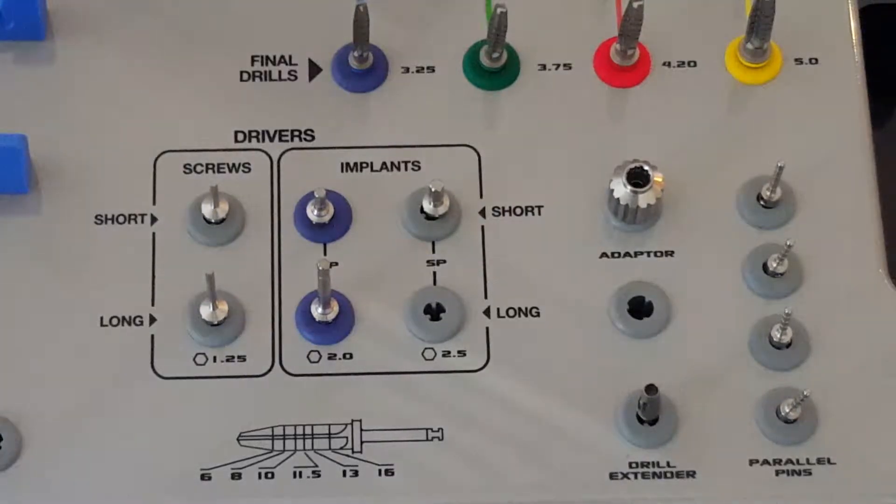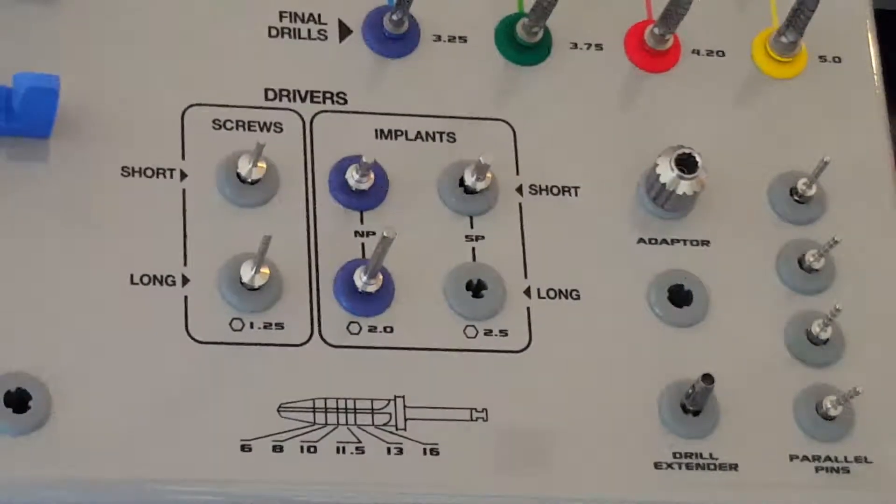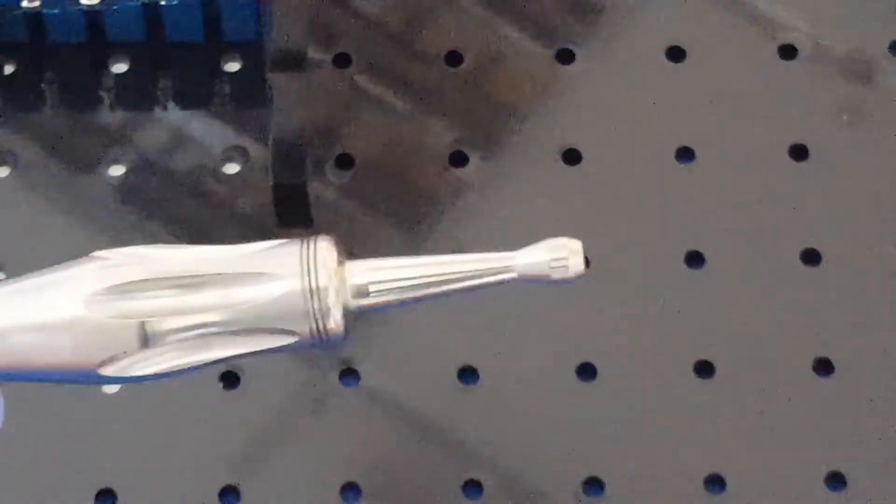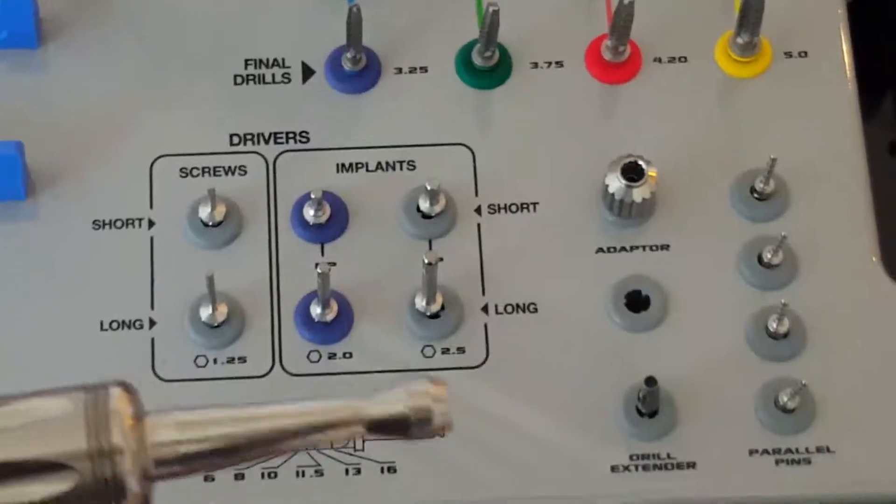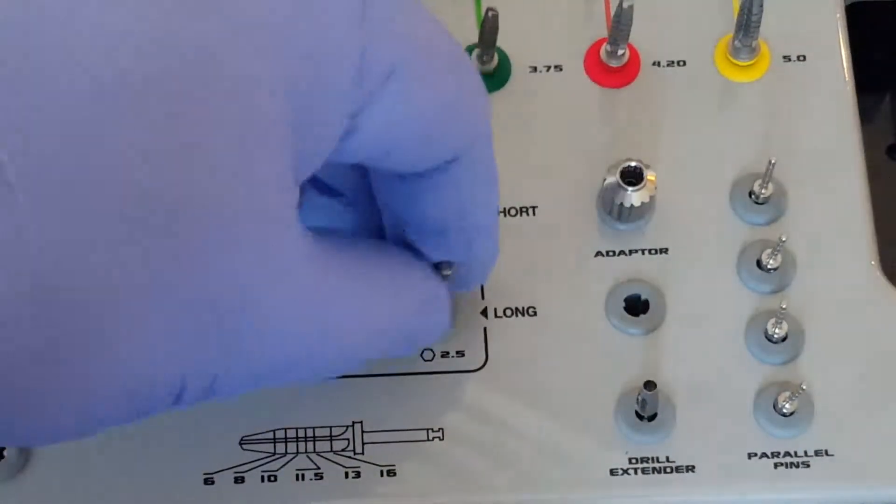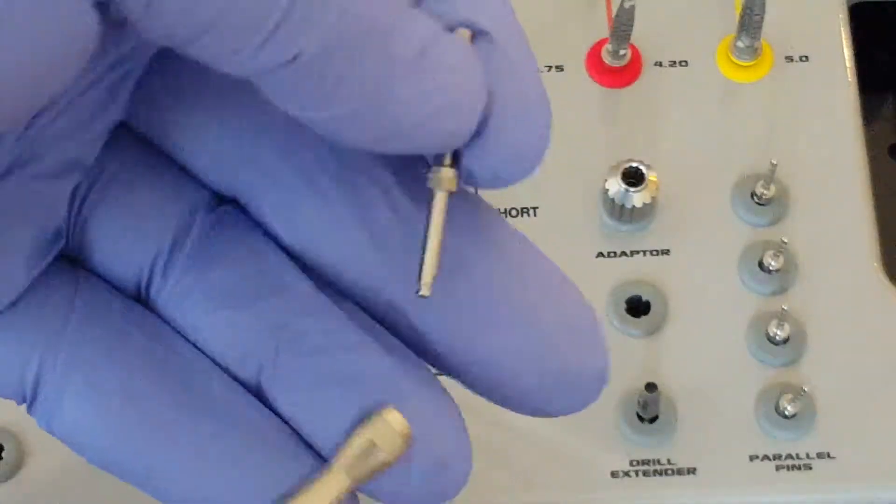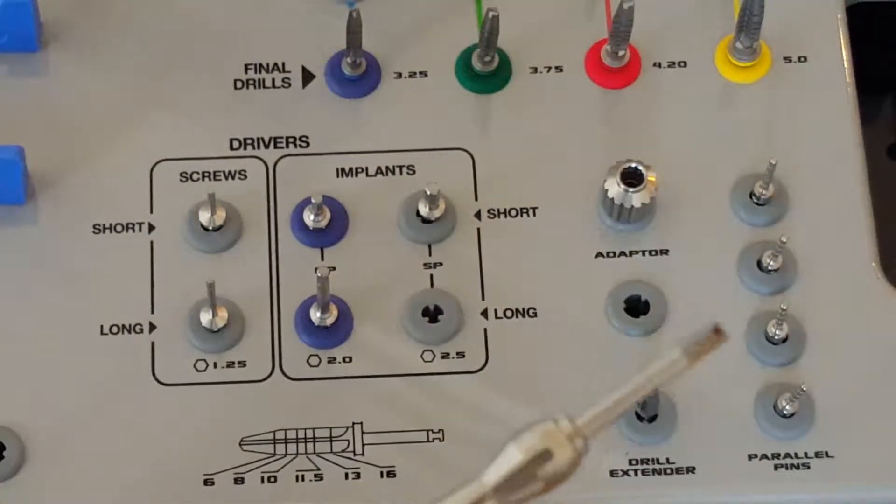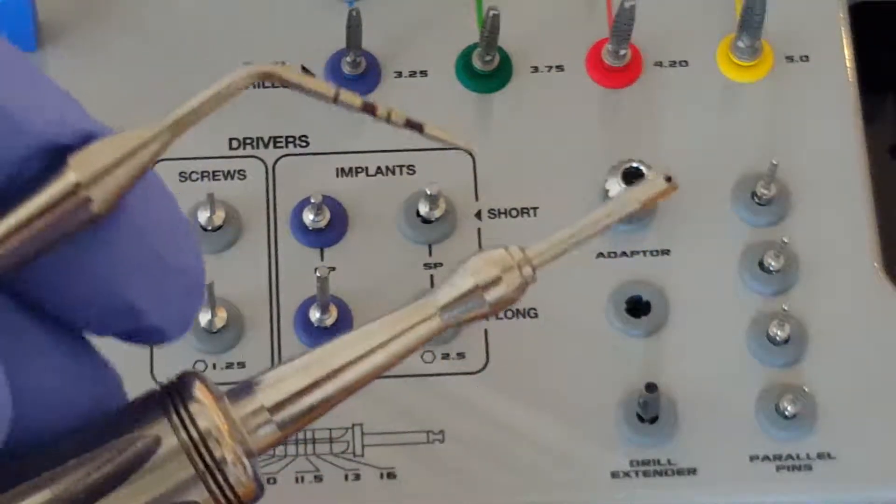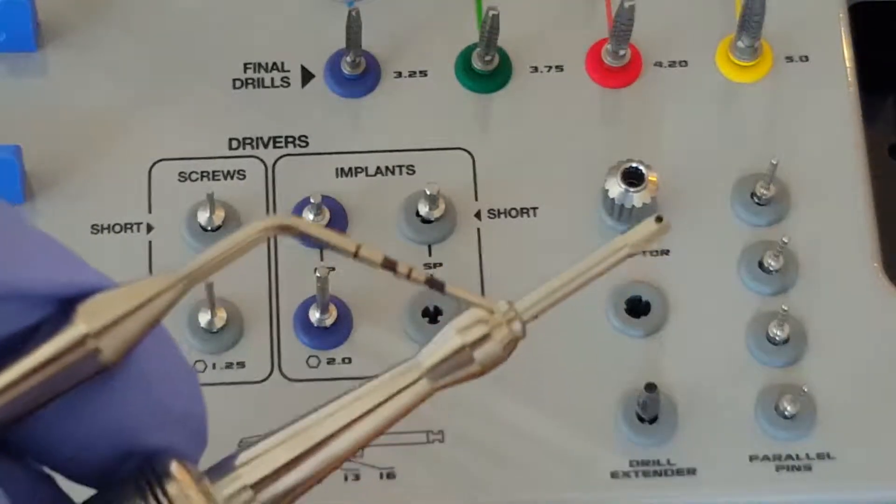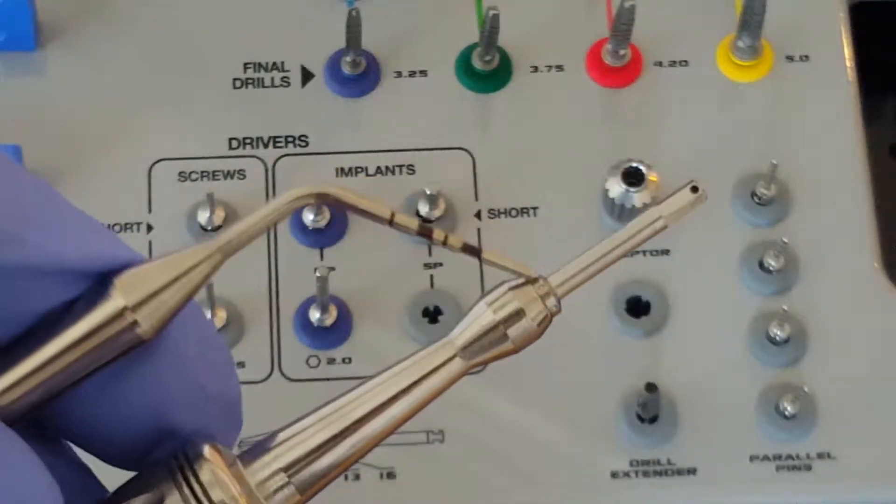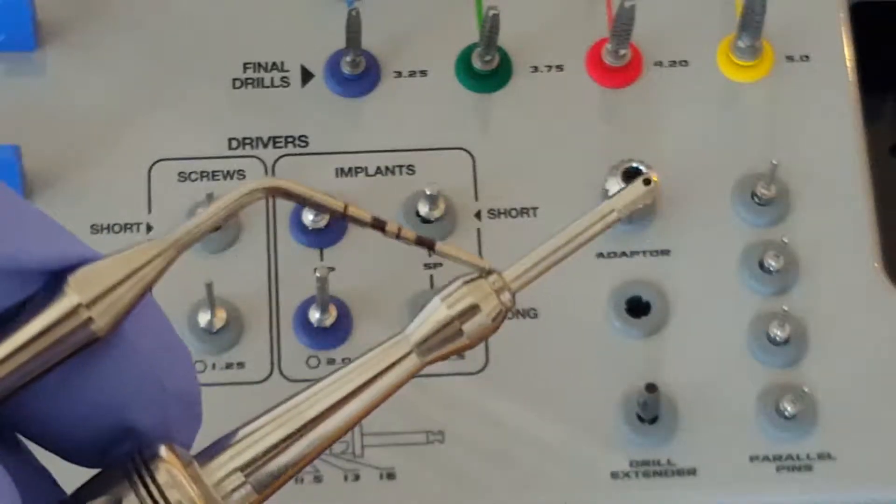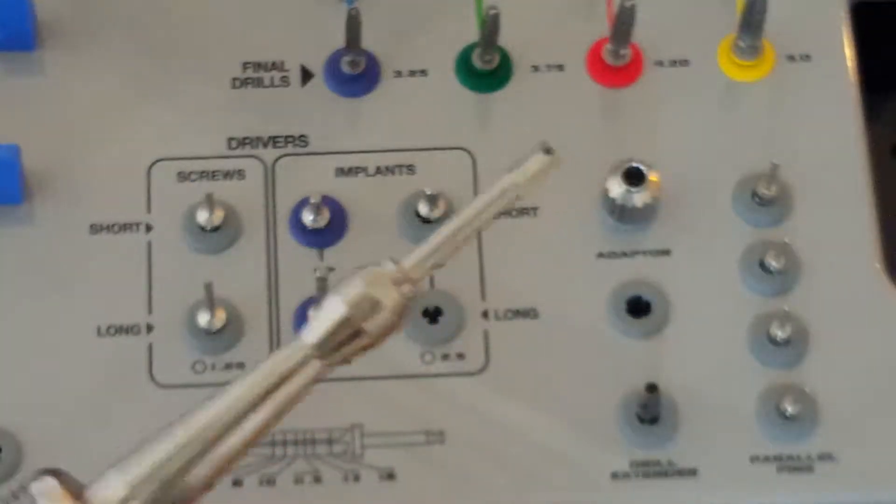We can also utilize one other device to insert the implant, utilizing the hand driver in the base of the tray. I can take the implant insertion key and slide it into the driver. On the driver I can see that there are dots. These dots correspond to the flat of the hex on the implant, so we can control the position.